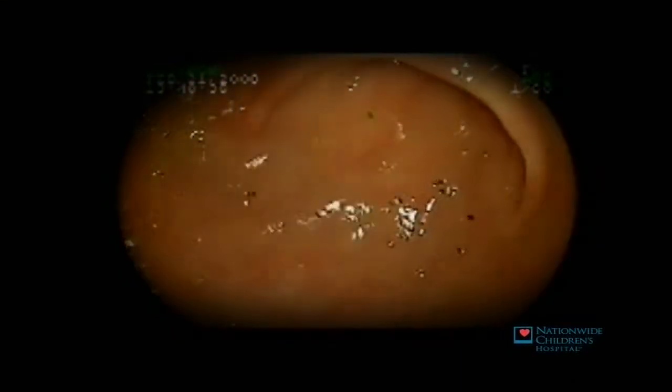The double balloon scope enters the intestinal tract through the stomach, which you can see here. This is the valve that separates stomach from small intestine. As the scope is first advanced, the balloon is inflated, followed by sliding the overtube down and also into the small intestine.